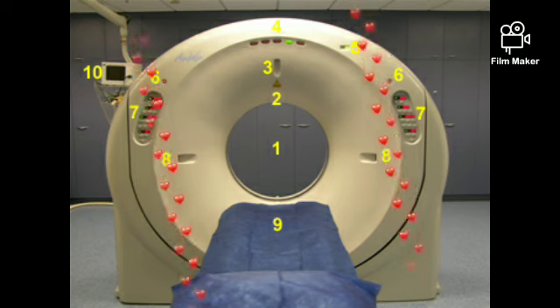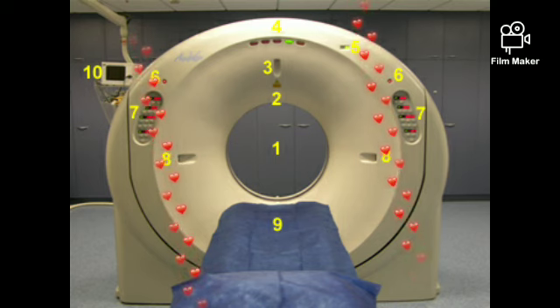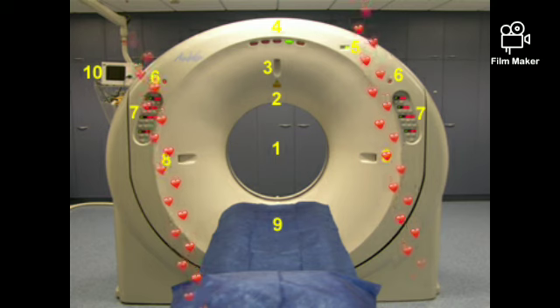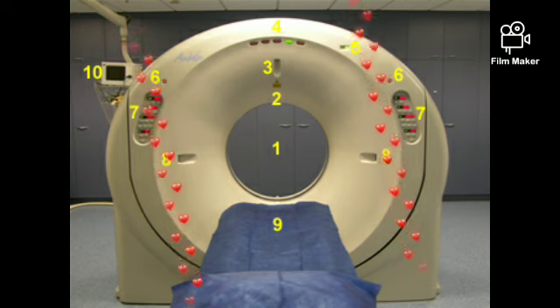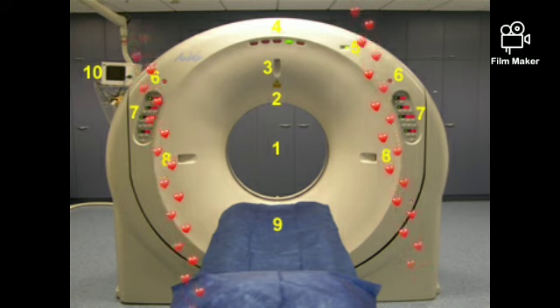reference line beam. It is going to give you the information about the coronal plane section. And even number two, there you can see one more point, that is known as the sagittal reference scan line. Okay, next is number six again, on both sides you can get the gantry control panel as well as our emergency button.